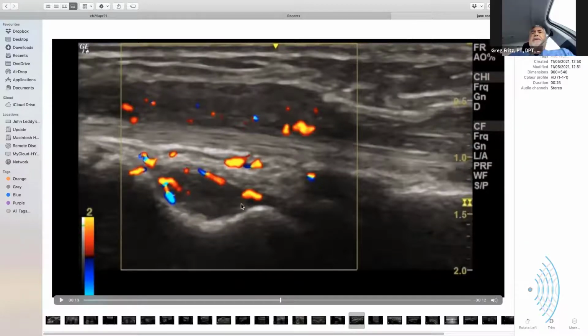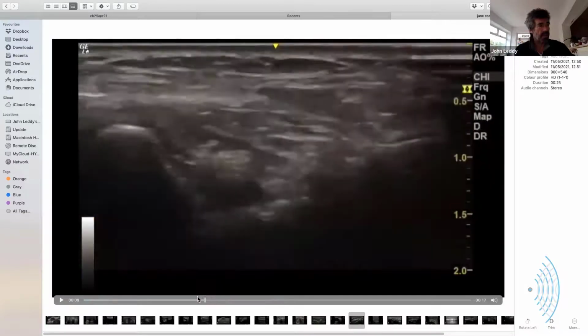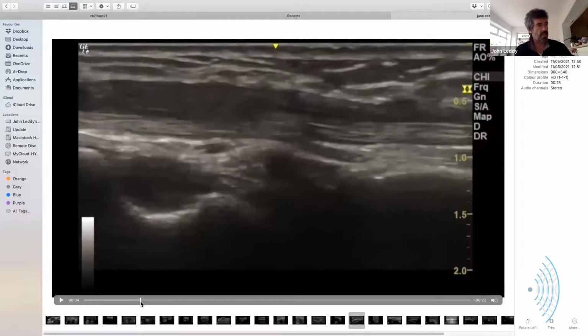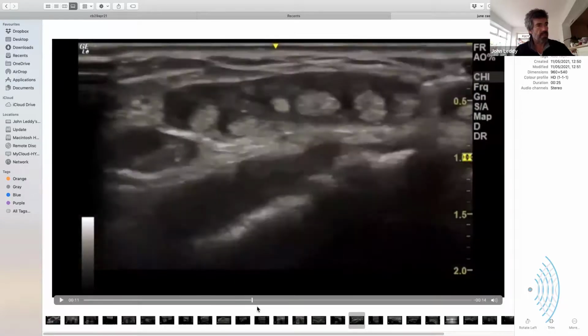Yes. And this is early onset of rheumatoid. This is the synovitis that you see at this level. And that's the very characteristic shape as you scan over the capitate, and you get the swelling here. It doesn't have to just be there. That's not the only place you look, but that is very characteristic of an inflammatory arthropathy.